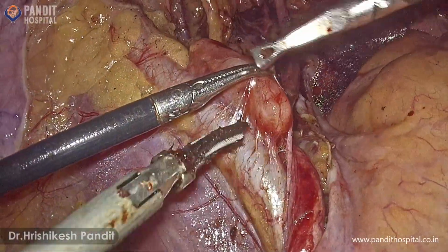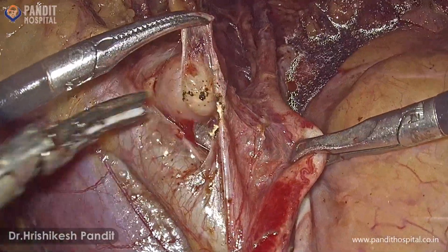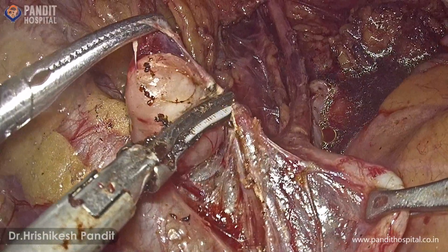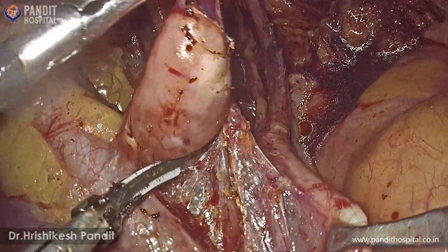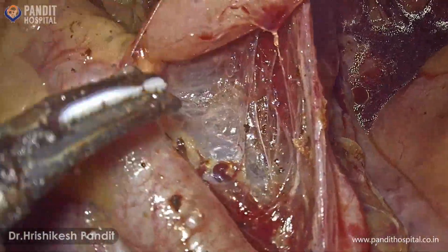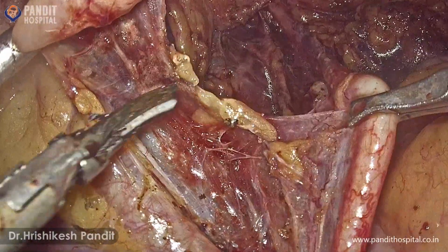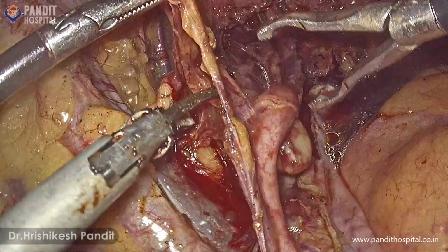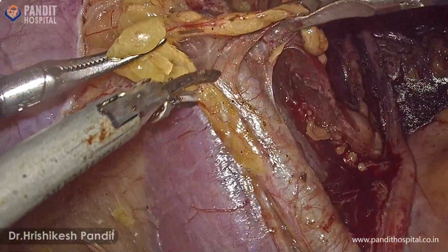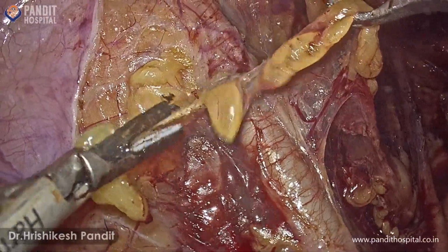We are dissecting the external iliac group of lymph nodes with millimeter by millimeter dissection, preventing any injury to the external iliac vessel. The assistant guards the ureter. We need not dissect beyond the genitofemoral nerve. Care is to be taken to prevent any damage to the genitofemoral nerve, as it will then cause numbness along the anterior thigh and the labia.